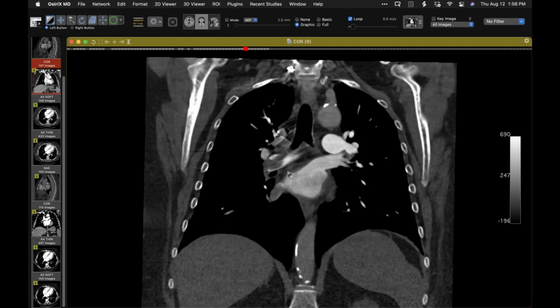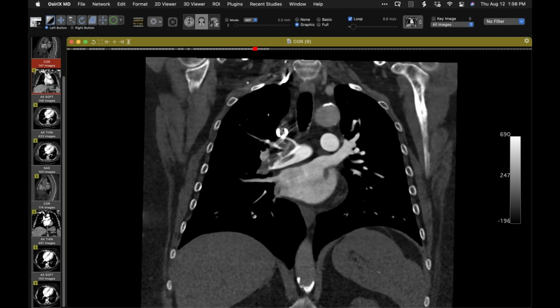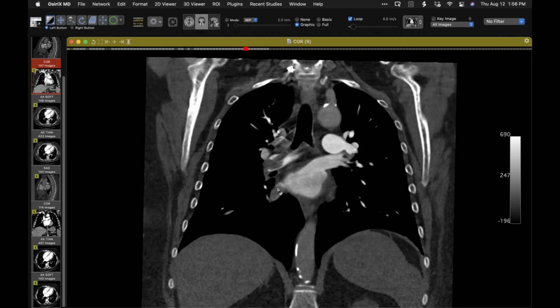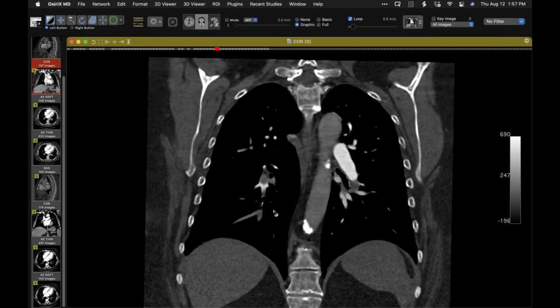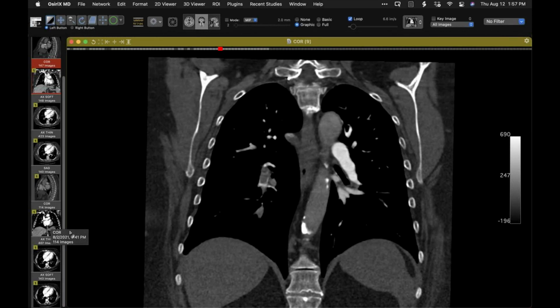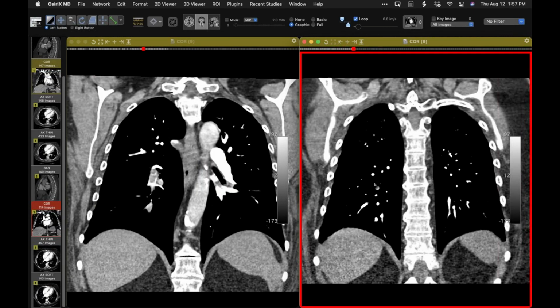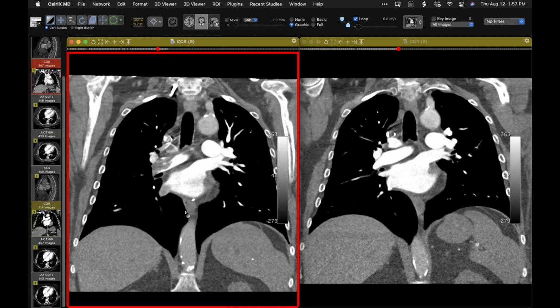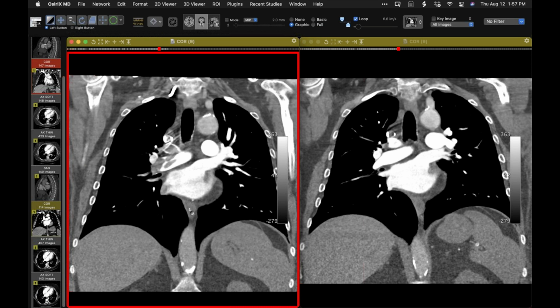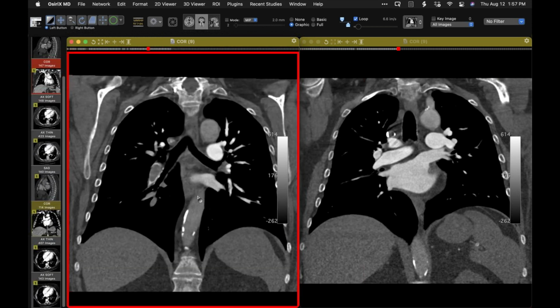But I think if I saw that again, I would still worry about it in the next patient I see like this. Is there any reason why anyone would be really confident that that's not a sarcoma with this kind of appearance? Yeah, I think it's just that you have the more tubular portions, and I wonder how much of this is in situ clot that just forms on the initial embolus. Yeah, it gives it more of that mass-like appearance. And the other thing is sarcomas expand the vessels quite a bit, and you frequently see big bronchial arteries. It's also possible that the fat part of this clot is a coiled up, thinner tubular portion that's just bunched together, that it folded up there.